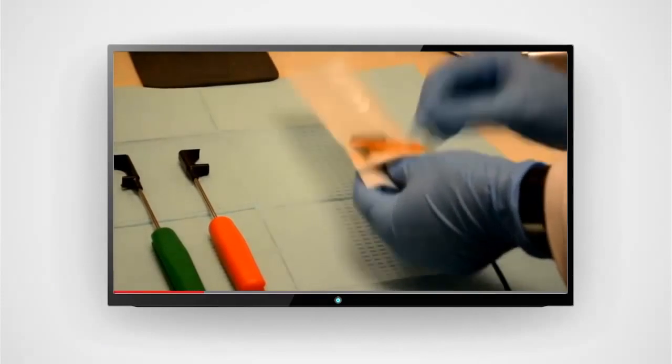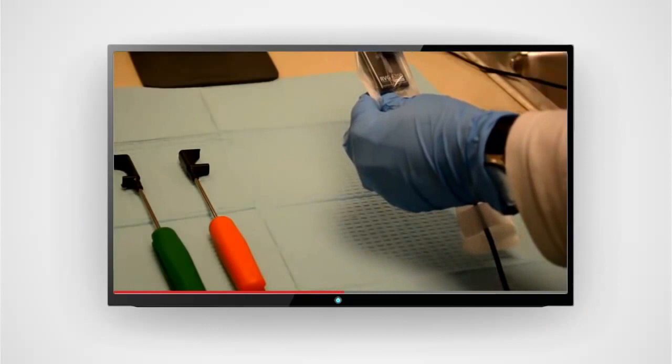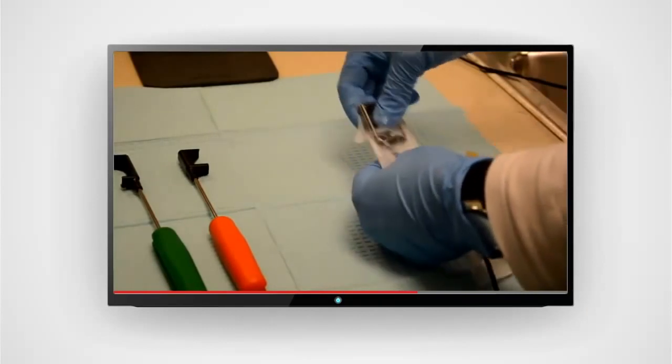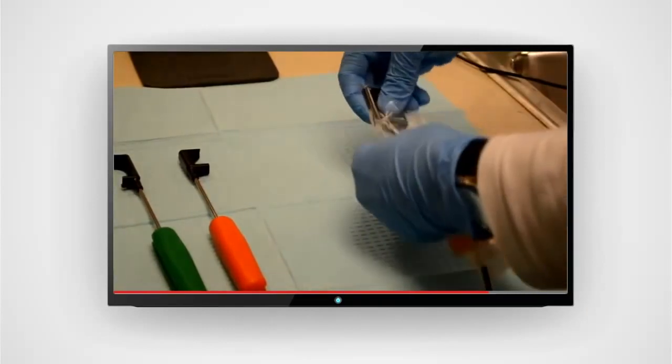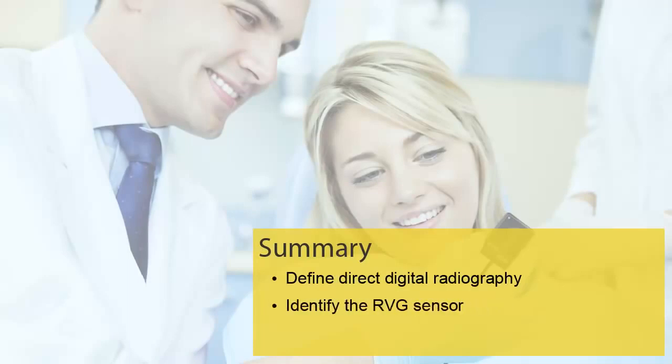After you select the barrier, slide the sensor into the barrier. Make sure that the barrier slides all the way down on the sensor. If necessary, use your thumbs and forefingers to push the sensor to the end of the barrier. You should now be able to define direct digital radiography, identify the RVG sensors, and prepare the sensors for use.